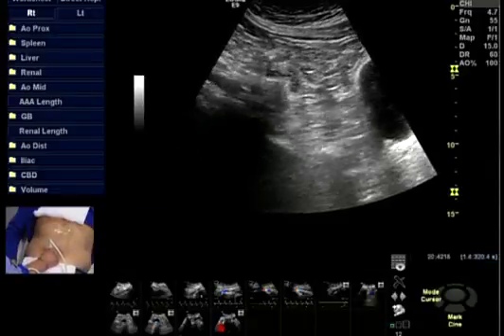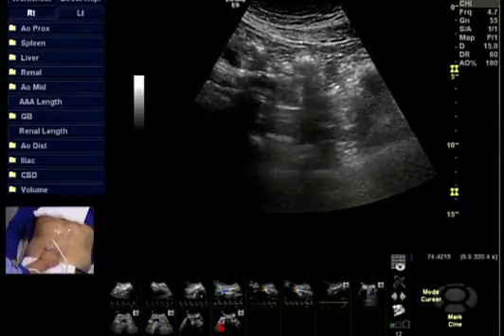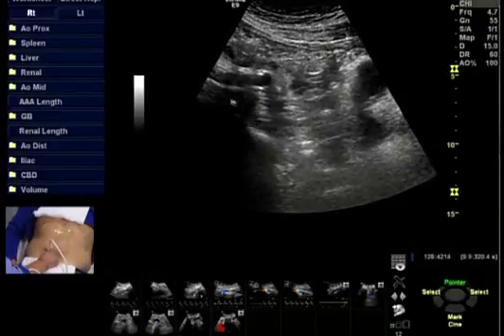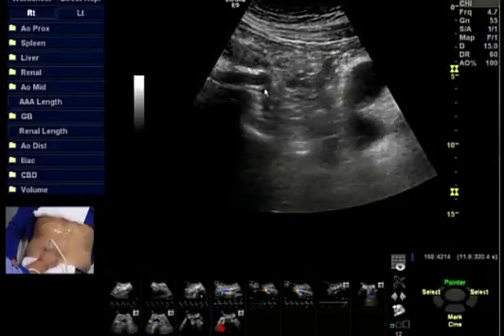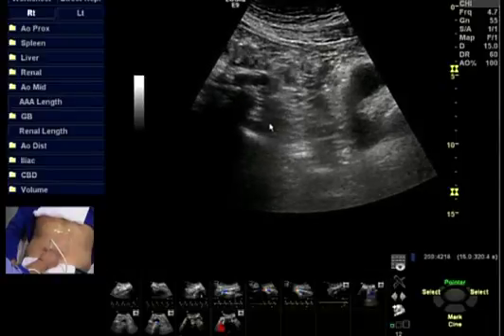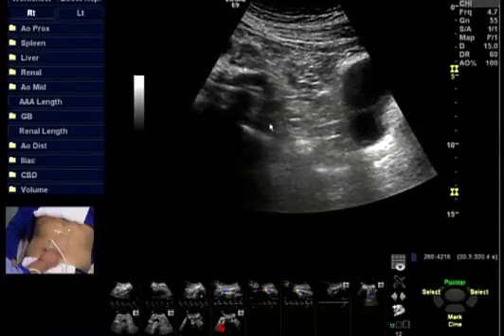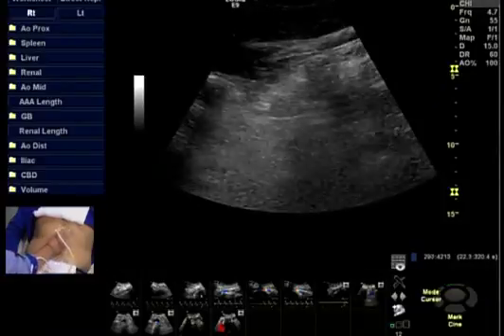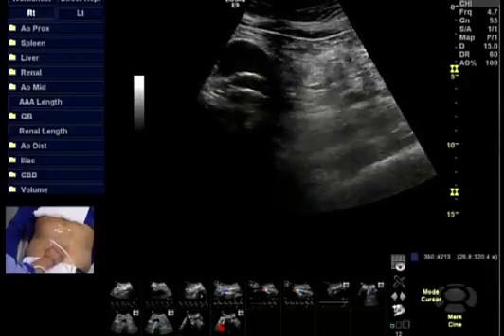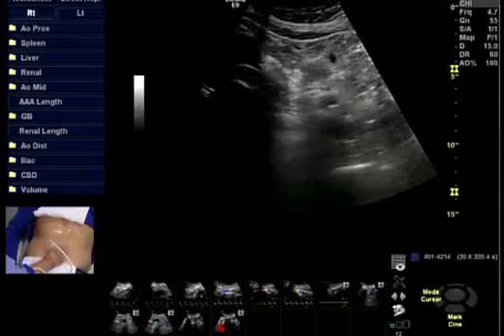As you then proceed to image, where the endograft ends is where the vessel becomes very, very tortuous. The endograft ends right here, and this is where now the iliac starts to dive very deep. It's going to be very difficult to follow. So we've seen the right side. Let's go back up to that bifurcation point again, right below the umbilicus. Angle now over towards the left leg and follow the other limb.